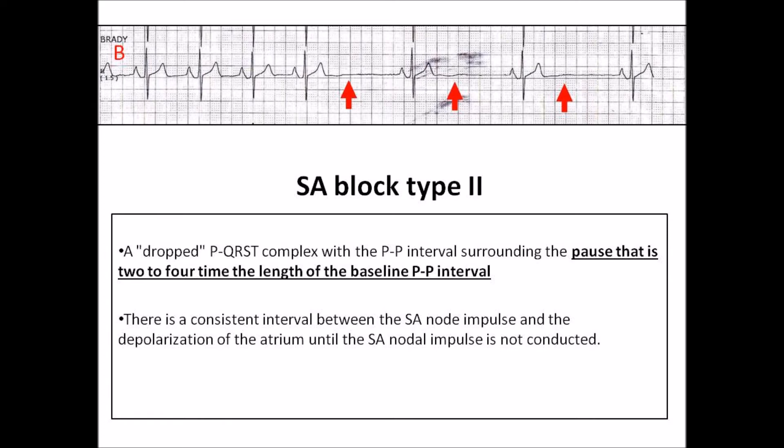Sinoatrial block type 2. In sinoatrial block type 2, there is a dropped P-QRST complex with a PP interval surrounding the pause that is 2 to 4 times the length of the baseline PP interval. This is because there is a consistent interval between the SA nodal impulse and the depolarization of the atrium until the SA nodal impulse is not conducted. In this strip, there is complete absence of the expected P-QRST. The surrounding pause is equal to 2 times the baseline PP interval.